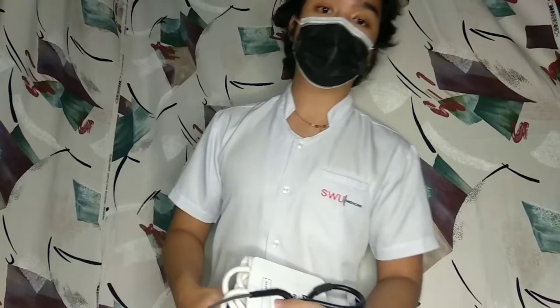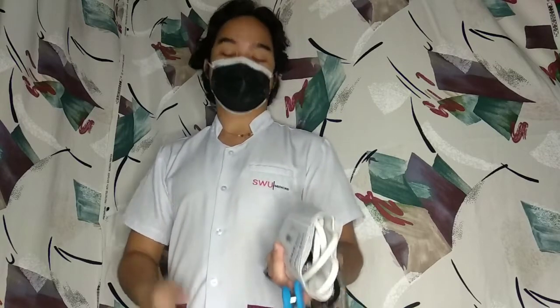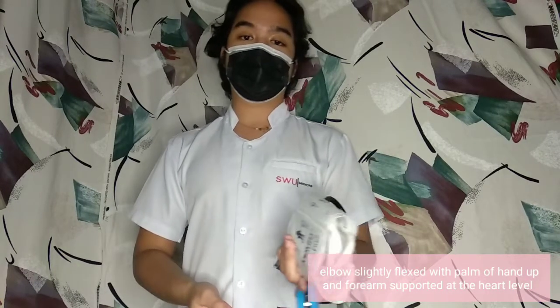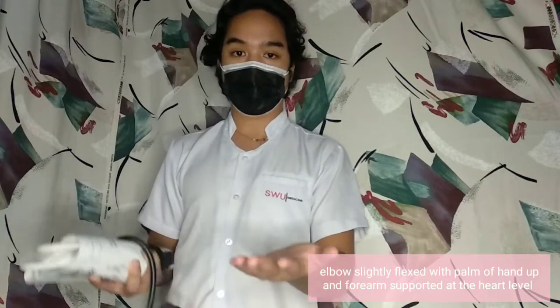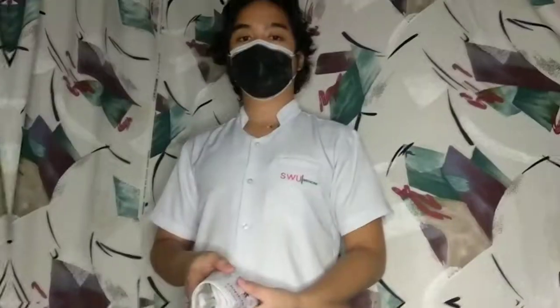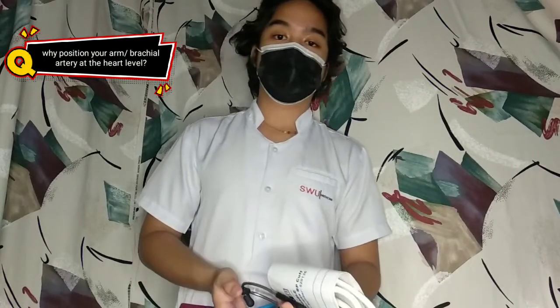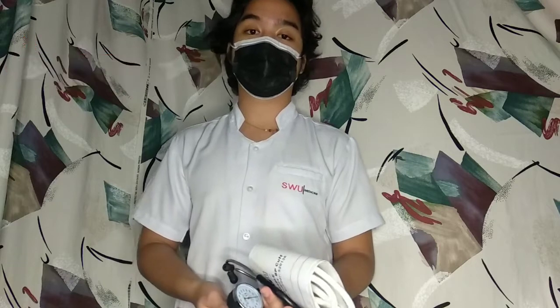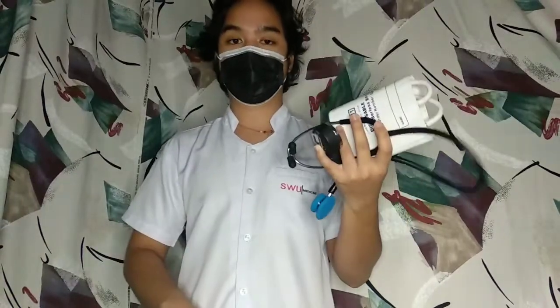You also need to place the client's arm to rest on an armchair or on a table, which is at heart level, so that the elbow is slightly flexed and the palm facing up. Because if the brachial artery is below the heart level, the blood pressure reading will be high. But if you position your brachial artery above the heart level, the blood pressure reading will be low.